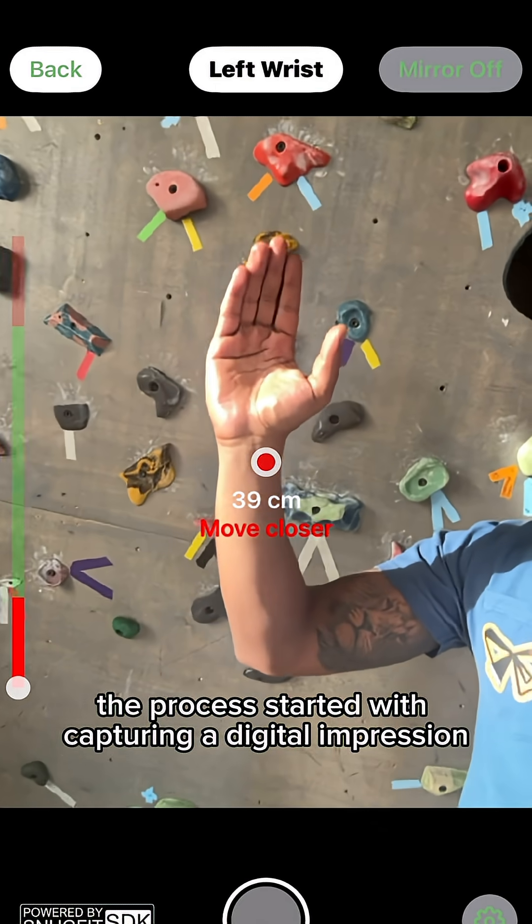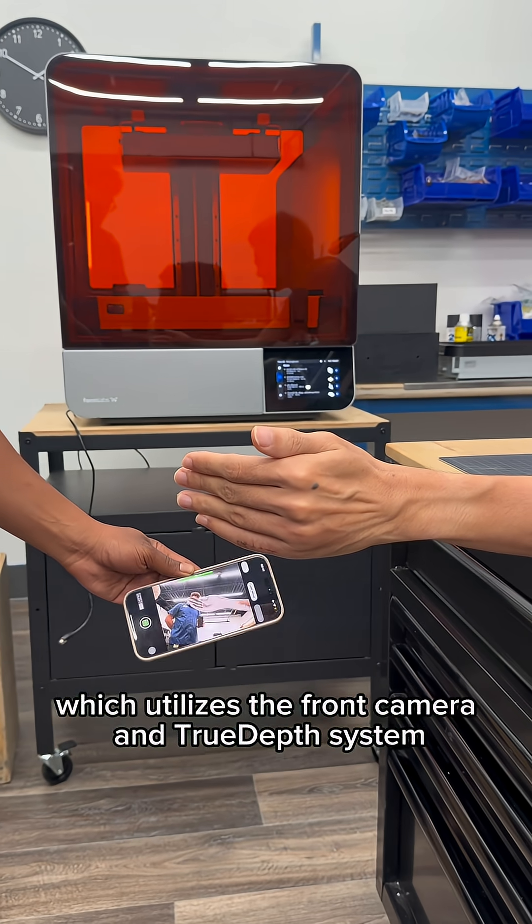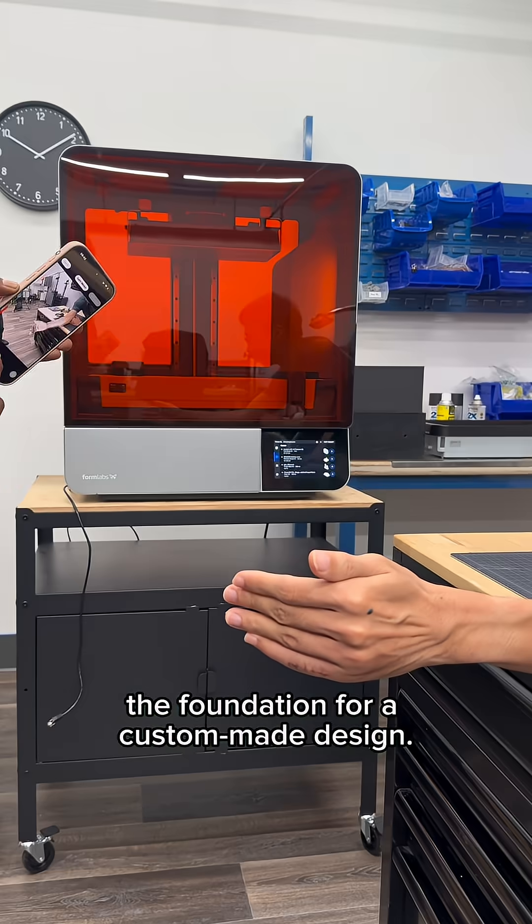I used a Snug Fit app on my iPhone, which utilizes the front camera and TrueDepth system to capture a 3D scan of the hand — the foundation for a custom-made design.